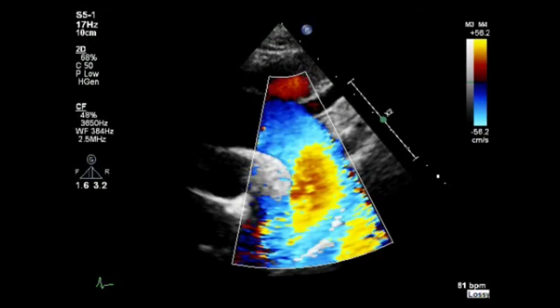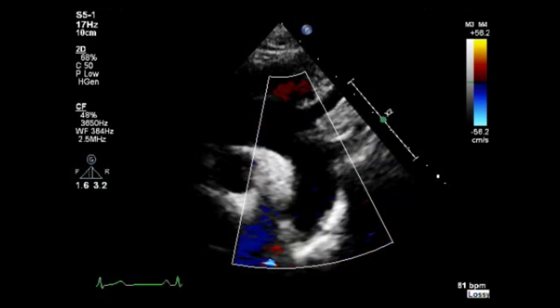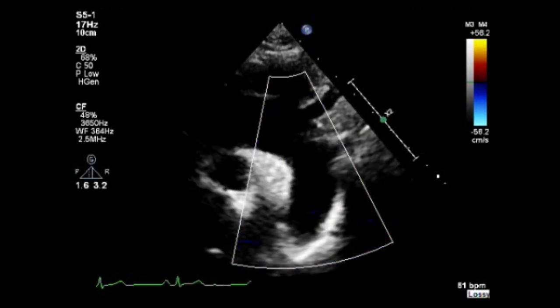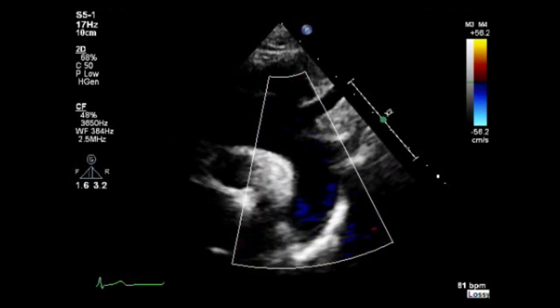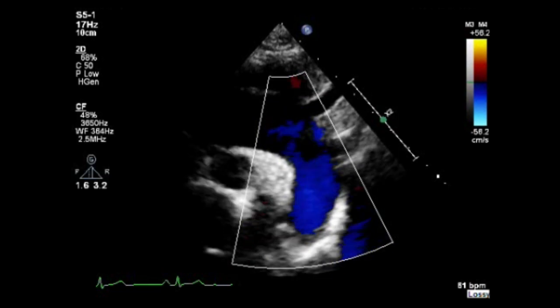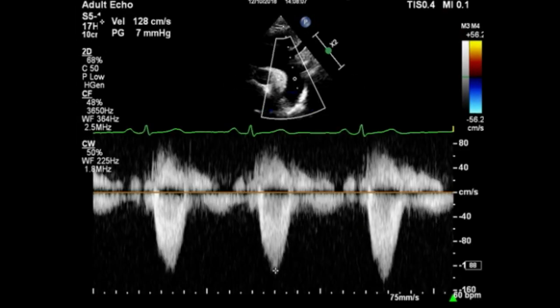Use color Doppler on the aortic arch and descending aorta and look for any abnormality in the blood flow. Now assess the forward flow — use continuous wave Doppler on the descending aorta and measure the peak velocity flow.